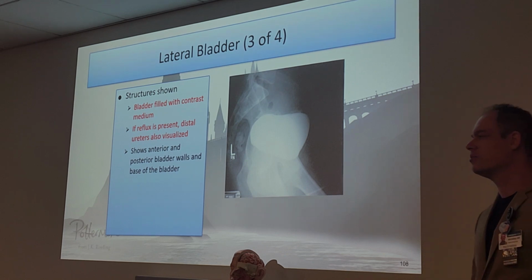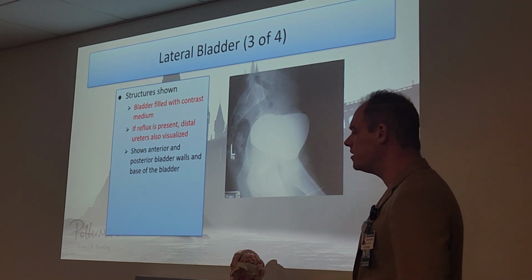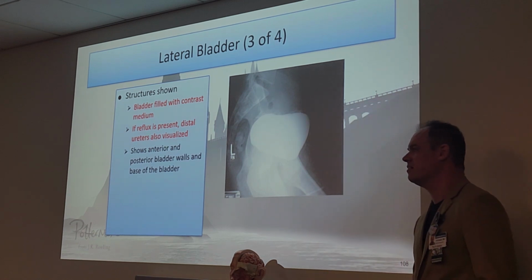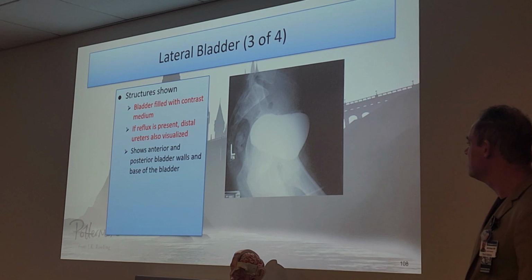Ureters, bladder, urethra. In ureters, you're only going to see if there's reflux present, which would be a bad thing. We don't want to see reflux. That patient is very painful.